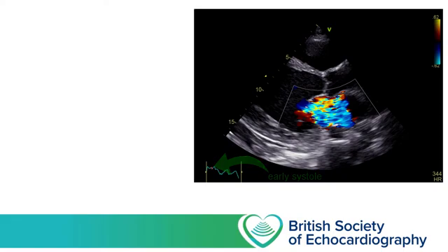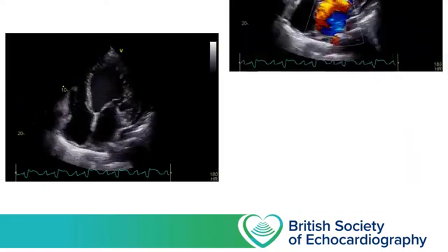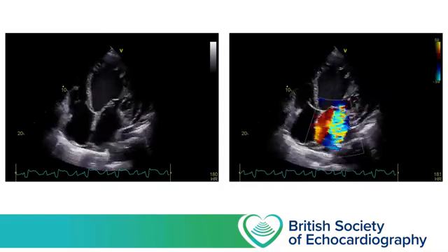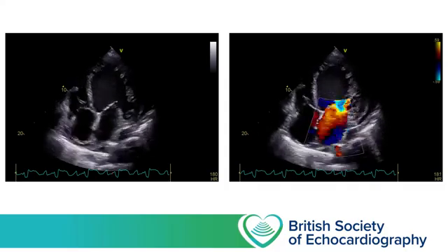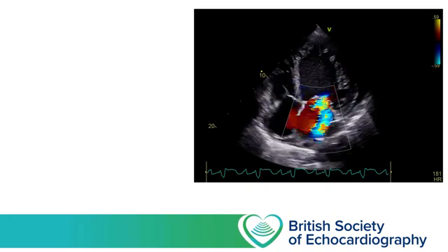And here we have a left atrium completely full of high velocity flow. If we take a look at the apical 4-chamber view, this confirms what we know about the dilated and poorly functioning left ventricle, and with colour placed over the left atrium, we can see that even though the LA is dilated, the jet fills the majority of the LA area.